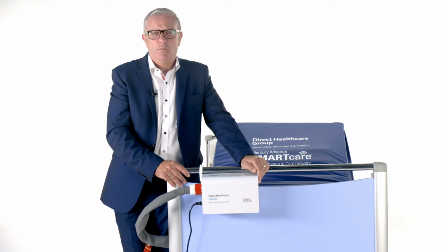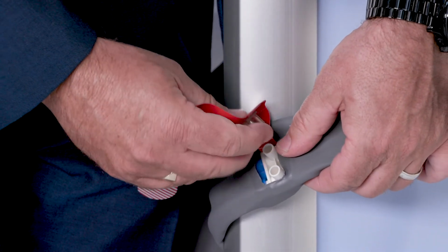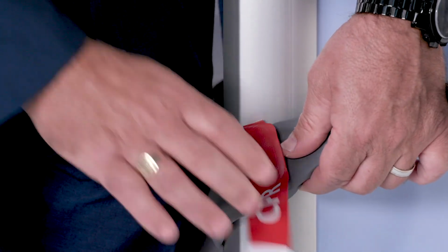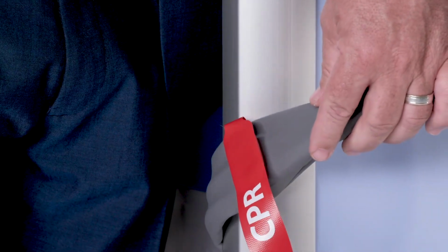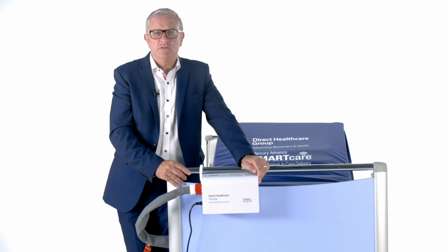In this case, the pump should be turned off and the CPR tag opened to allow some air to escape. The CPR tag is then closed firmly to ensure that no air can escape. The pump should be turned back on to resume alternation. In the event that none of the previous troubleshooting rectifies the issue, you should contact Direct Healthcare Group if you purchased directly, or whichever local company you have purchased the mattress from.